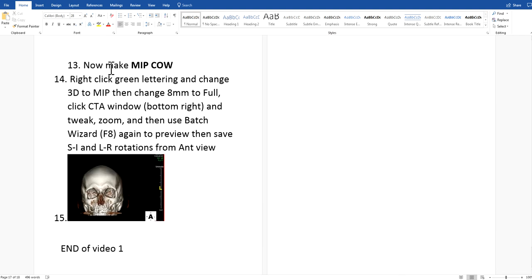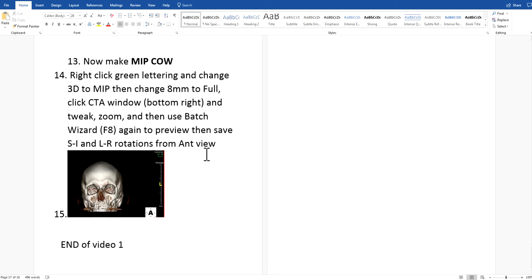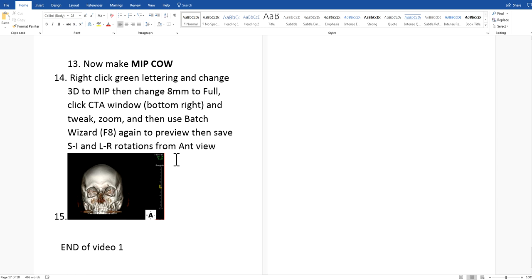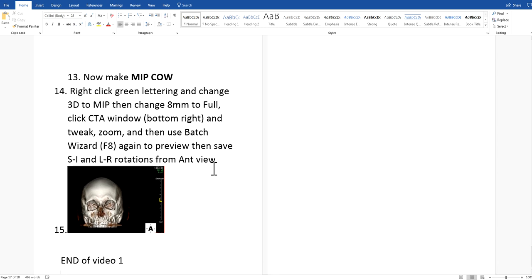To make the MIP COW movie, right-click the green lettering up here and change 3D to MIP, then change 8 to full, click the CTA window at the bottom to get a good window, and tweak a little. Then make two more movies using batch 3D. That's the end of video one — see video two for examples of how to do it. Bye-bye.